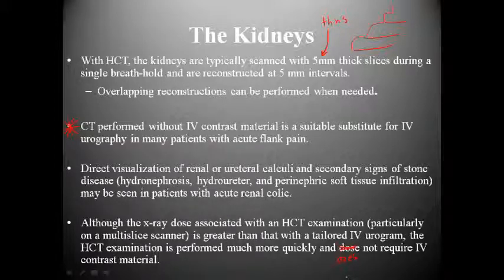Okay, but the thing that I like to focus on when you're doing a CT of the abdomen pelvis and you're solely looking for kidneys, typically, even though the patient may be experiencing signs and symptoms that lead you to the kidneys, there's no guarantee that everything is a result of the kidneys. So if the patient is in severe pain, that's why abdomen pelvises without are such an integral part now of medicine, because you can get the patient on the table, get the patient scanned, and the patient back to the room in usually under 10 minutes.